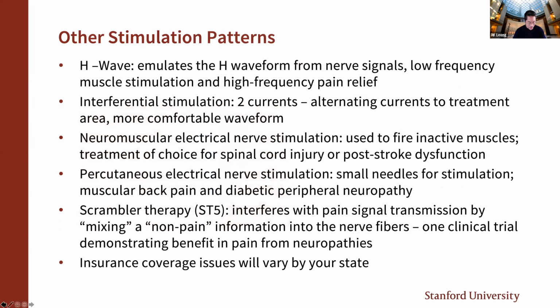Now, there were a lot of other stimulation patterns that Emily actually asked me to discuss, and I had to group them together so it would be a little bit more cohesive, and I think some of them dovetail off of what we just talked about. And so some of the upper ones, like an H wave and interferential stimulation, I actually prescribed or had knowledge of a little bit earlier, quite a few years ago.